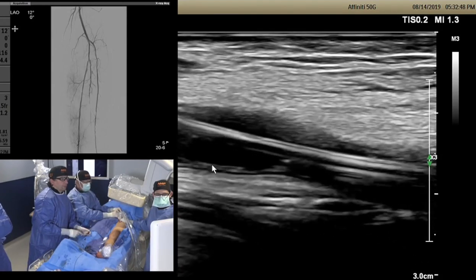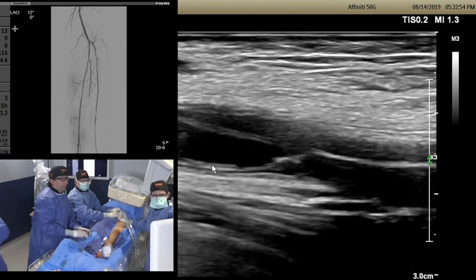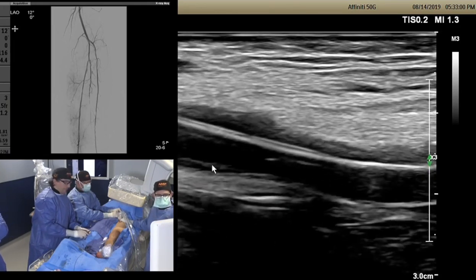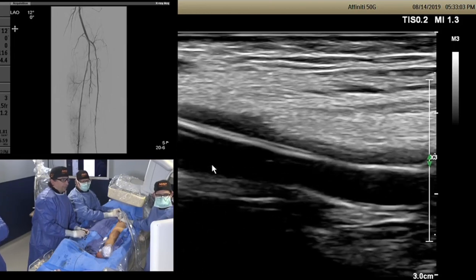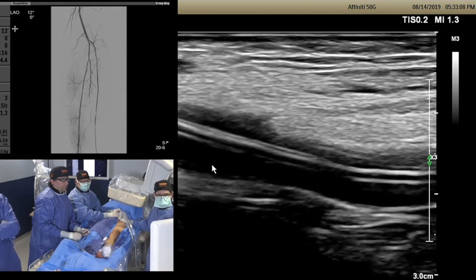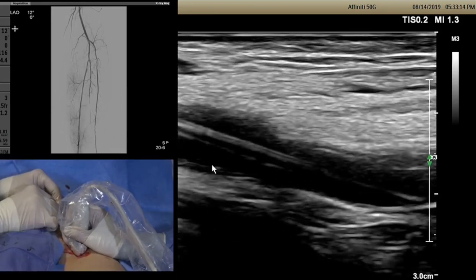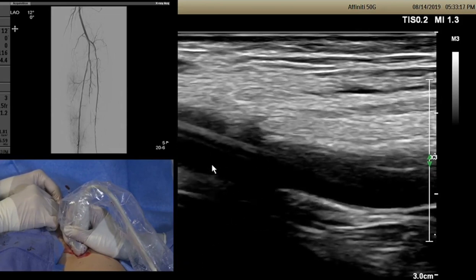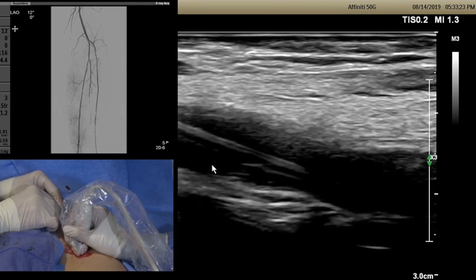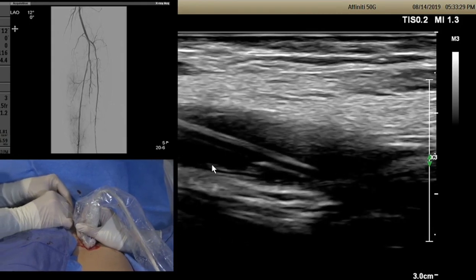We're pulling the sheath while keeping the Navicross inside the leg. I have an 018 V18 wire inside the Navicross catheter. We're trying to engage the ostium of the SFA under ultrasound guidance. I cannot do it under fluoroscopy because of the flush occlusion. It might be a little bit challenging but we're going to try. It's a very good idea to do this under ultrasound guidance.